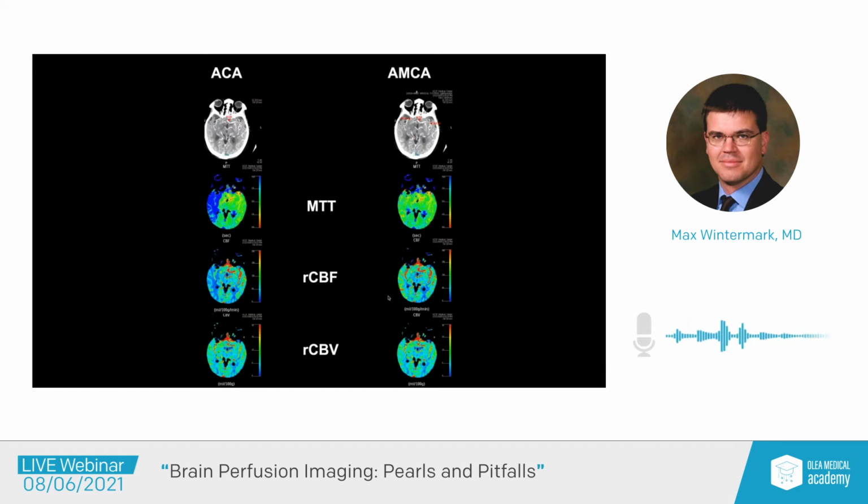And so on the left side, we process the exact same data set using the anterior cerebral artery. And as you can see, again, because the patient has this right internal carotid artery occlusion, when I pick the ACA, the anterior cerebral artery, well, the timing of the time density curve in the ACA does not reflect the occlusion of the right internal carotid artery. And so as a result, in the right ACA territory, it's okay because the ACOM and the other, the contralateral, the left ICA helps.